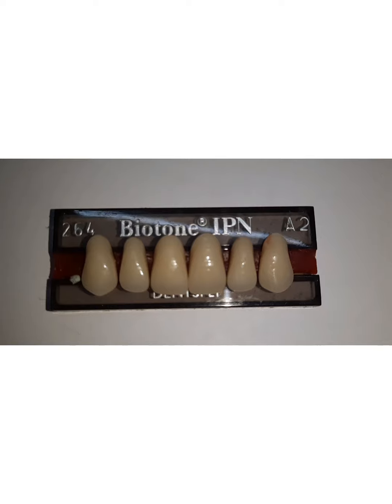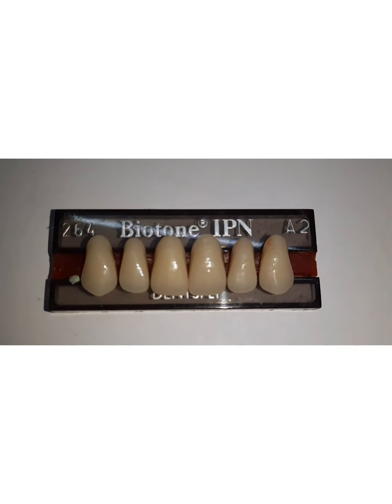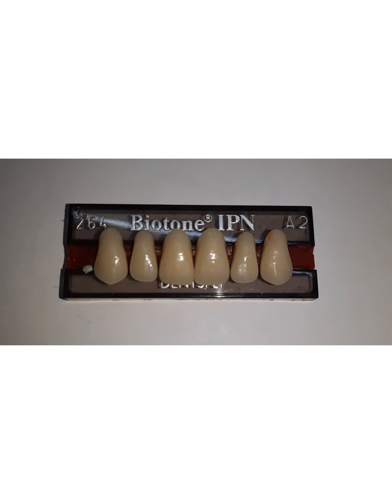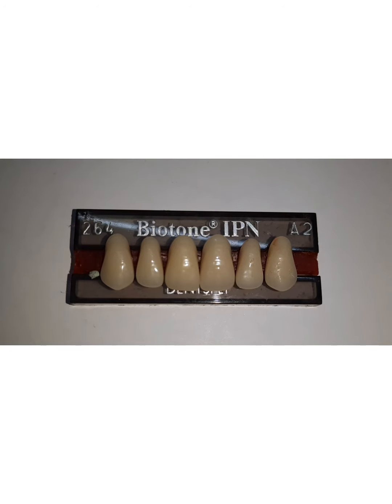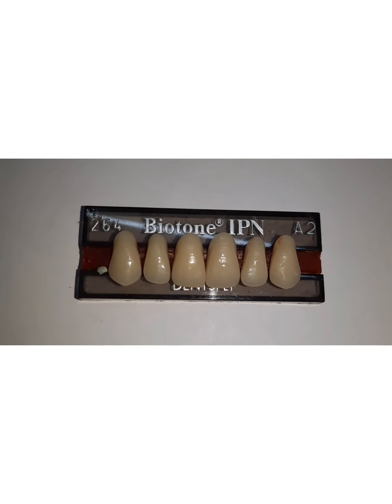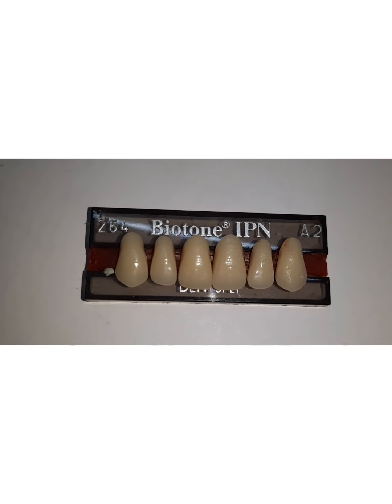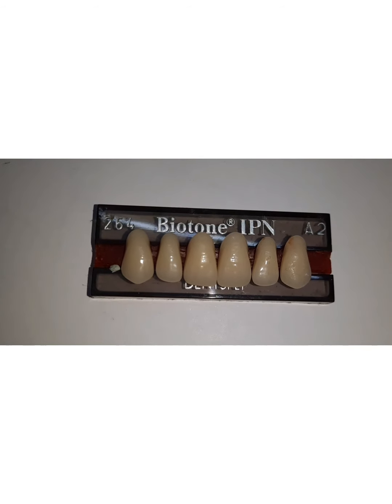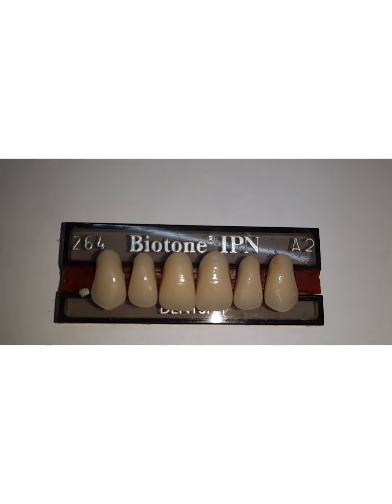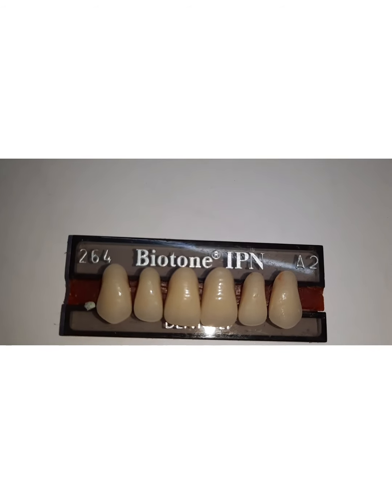As I told you, the most commonly used teeth in fabricating dentures are the acrylic teeth. Why acrylic teeth? Because they are easy to fabricate, characterization is possible, they have superior aesthetics, they can be easily repaired and adjusted, and they can be used with a metal base by the design of nail head or retention loops or diagonal spurs.